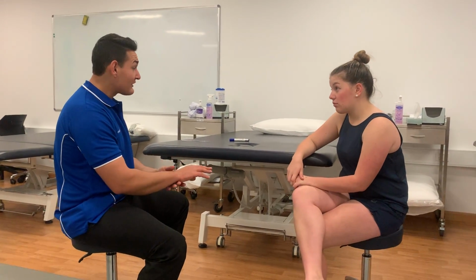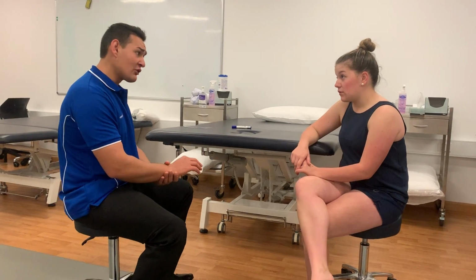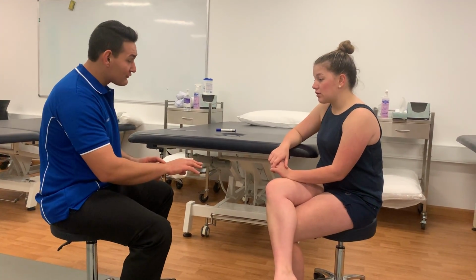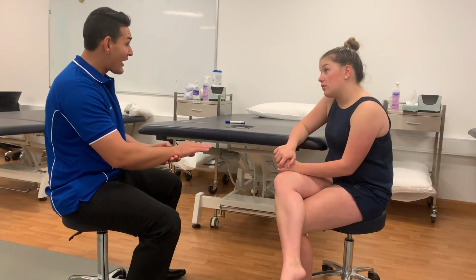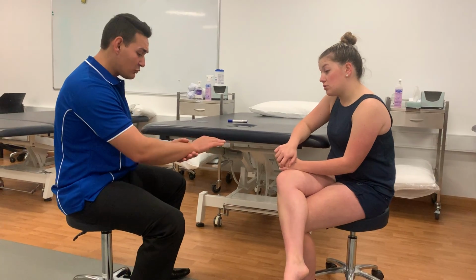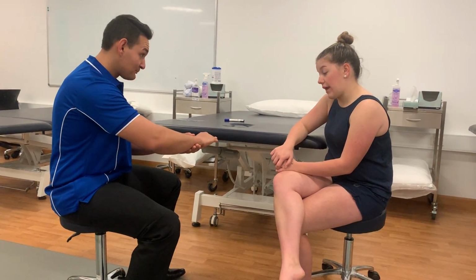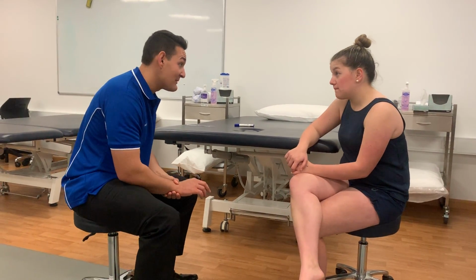So today I understand you've come in with pain in your right wrist. Yes, that's right. And that was just from playing squash a week ago now? Yes, that's right. Okay, so we'll have a look at that injury today. We're just going to do a measurement of your right wrist, it's called radial deviation. We'll have you seated at a 90-degree angle, and we're just going to move the hand in towards the thumb. That will possibly show us a little bit of what's going on in the wrist today. No worries.